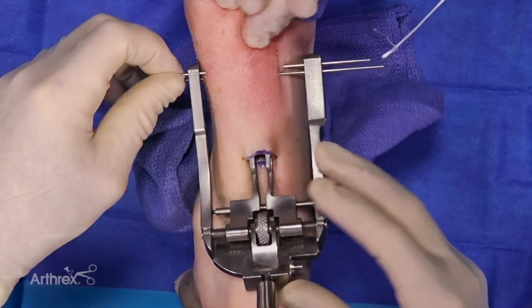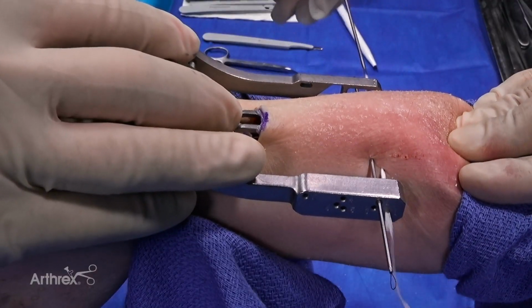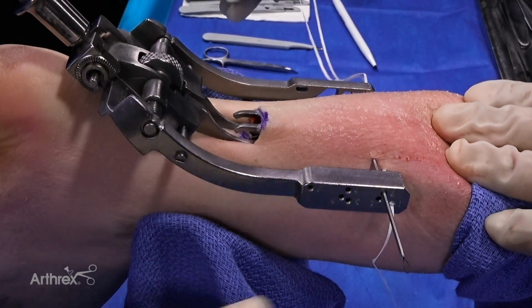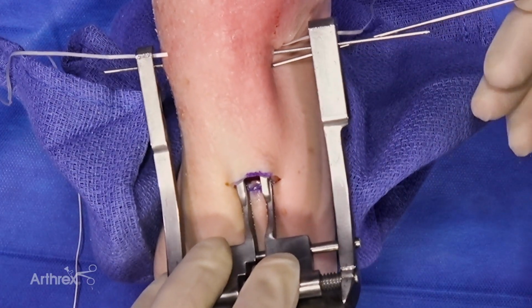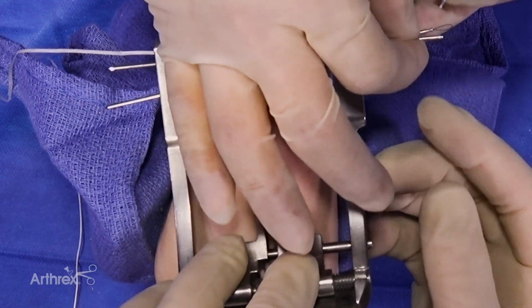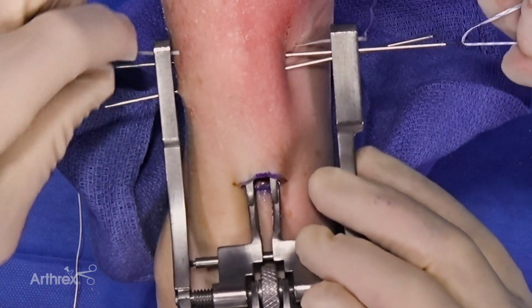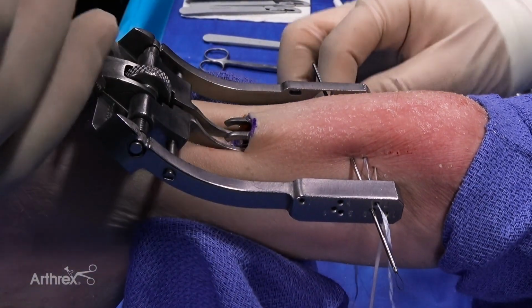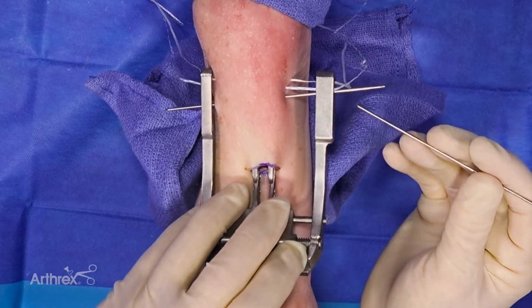So we'll go ahead and put the white one, that's our first one, in the number 1 needle, and I'll just draw that through. Now once I have that number 1 in, I then will stair step this down. So this needle then goes to number 3. Then I pass number 3, and then I'll take the blue stripe suture tape through the second needle. And again, with that idea of stair stepping down, I'll draw this through, leave about 50% on each side, and then put this in number 4.